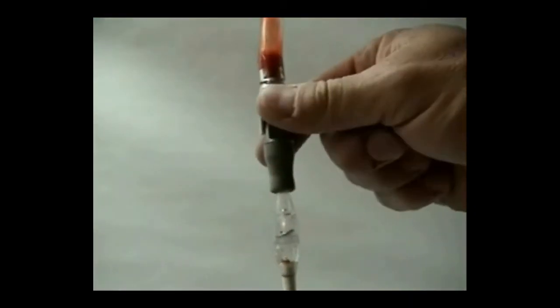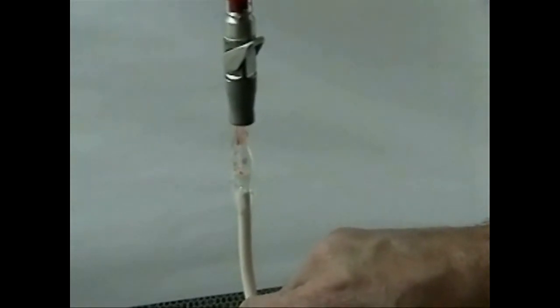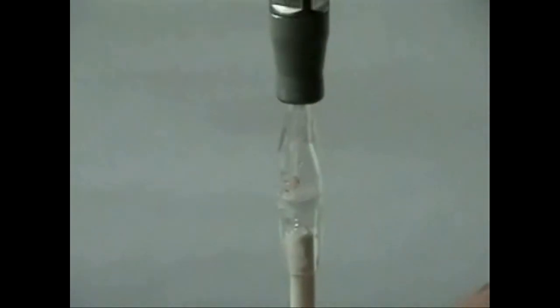In this video, you can see the valve open and close as the vacuum switch is also open and closed. In this video, you will see fluid backflow to the valve. The valve will close as the air is blocked to prevent the fluid from getting to the end of the saliva ejector.